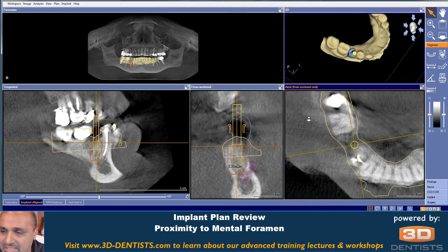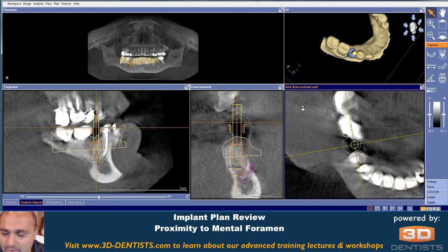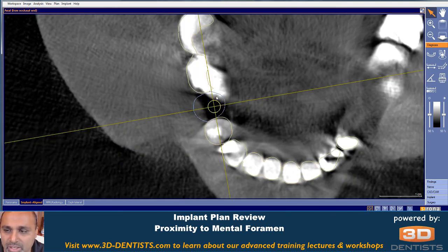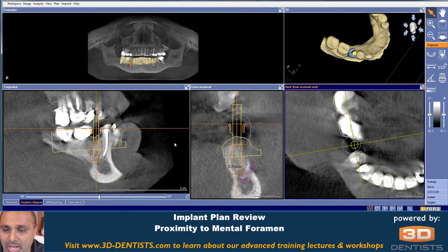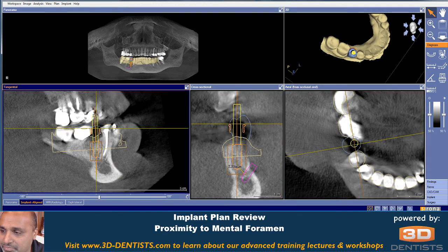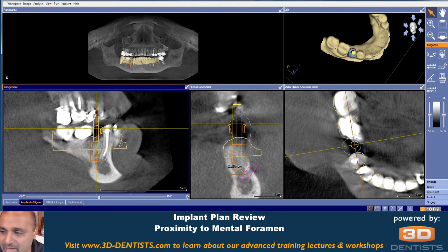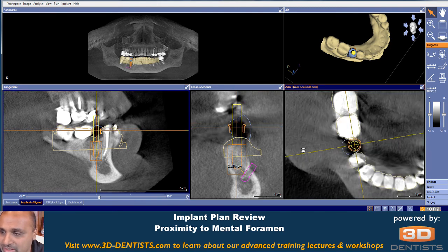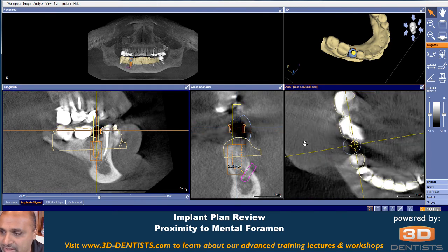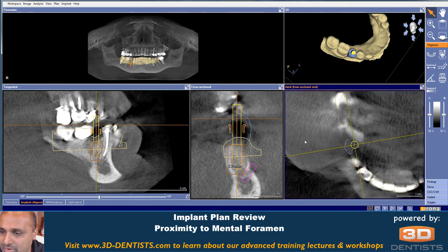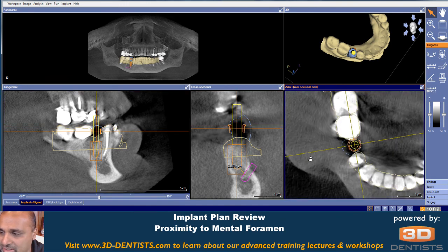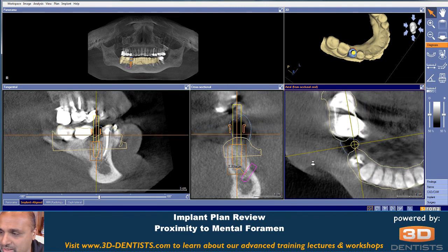The last thing I would critique is in the axial view: our placement is leaving more room to the distal than to the mesial. So I would possibly look at adjusting my plan so that the implant is a little bit more centered mesiodistally in our tooth.